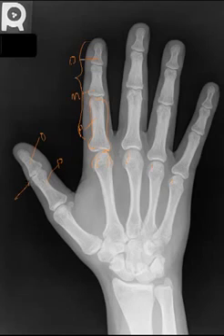Notice here, there's an interphalangeal joint between the phalanxes. This is an interphalangeal joint. If you notice on the second through fifth digits, there are two joints along the digit.